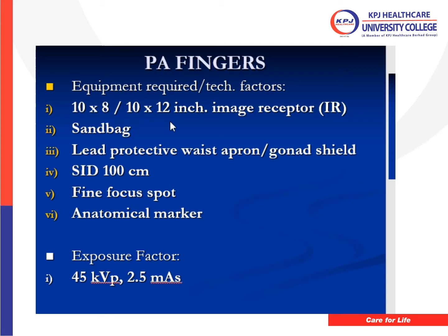Because the part is very small. Right, and then the use of the sandbag. What is the purpose of using the sandbag? It's for immobilization aids.